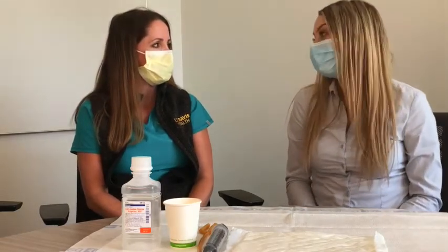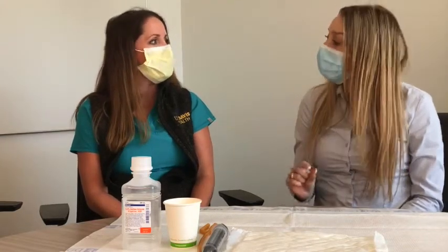Hi, I'm Lauren and today I'm going to teach you about how to perform rectal irrigation. My name is Taylor and I have to tell you I'm pretty nervous about this but I'm excited to learn. Don't be nervous, you're going to do great and the more we practice with it the easier it will get. Can you tell me just a little bit more about what rectal irrigation is?